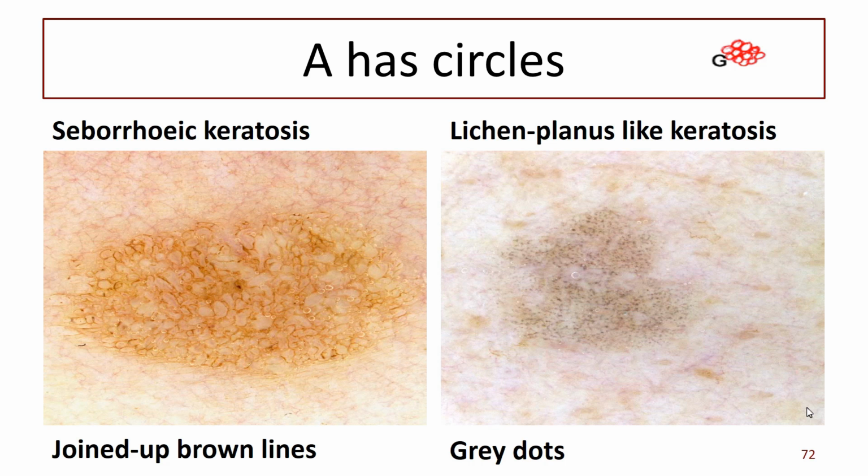So if you recall, I said to take good pictures, you need fluid on the skin. And isn't it funny that when you're used to looking at them, I can't even see those bubbles because I'm not looking for them because I know they're there and they're just in the way. Just like you don't notice whether a cat has big ears or small ears, they're just a cat.